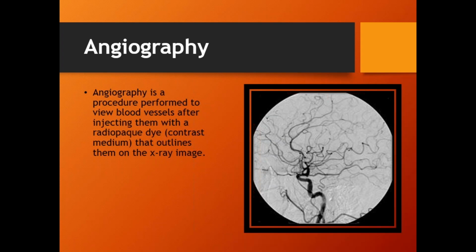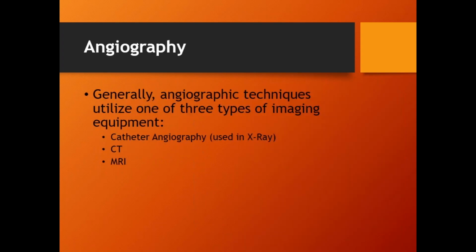And this is incredibly effective. The fluid in the contrast is incredibly effective at blocking X-rays. I mean, this is actually a brain scan, and you'll see how hair thin some of these blood vessels are. And just the microscopic quantities of contrast in those blood vessels are still enough to let them show up on an X-ray image. So when I say it blocks X-rays, it does it outstandingly.